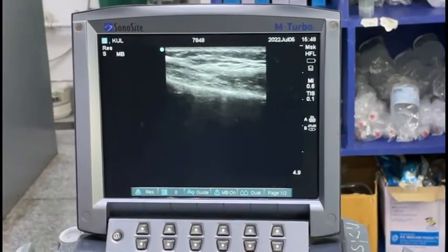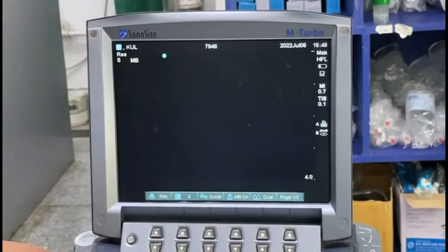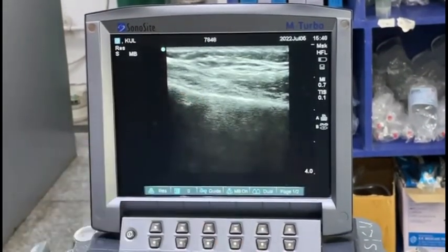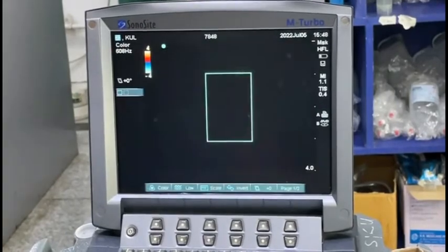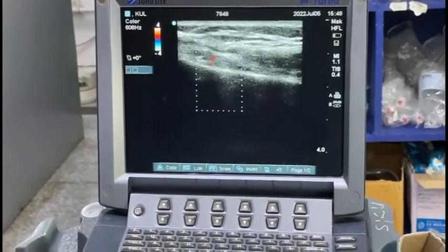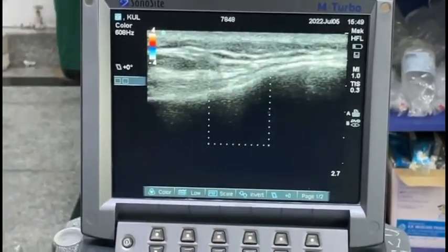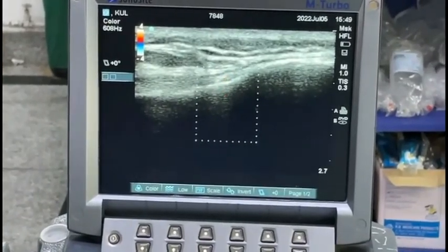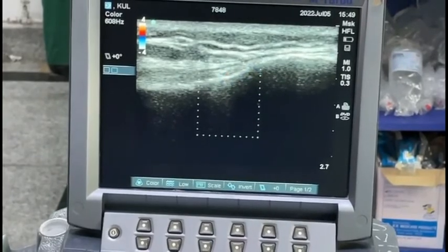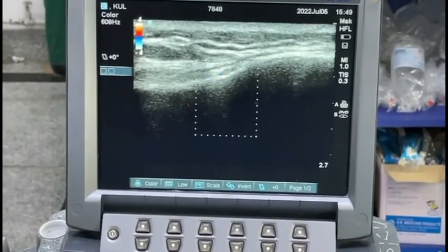When scanning for the superolateral genicular nerve, the landmarks are the femur and the vastus lateralis. Color Doppler can be used to locate the genicular artery, which is our target area. When scanning for the inferior medial genicular nerve, you can see the pulsatile genicular artery and the medial collateral ligament — the genicular artery is our target area.